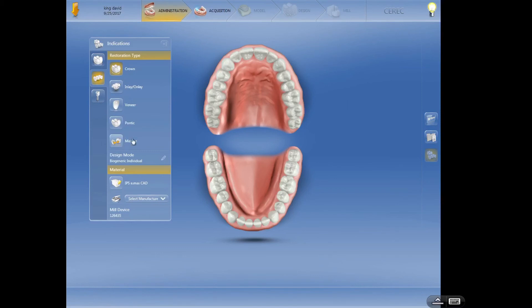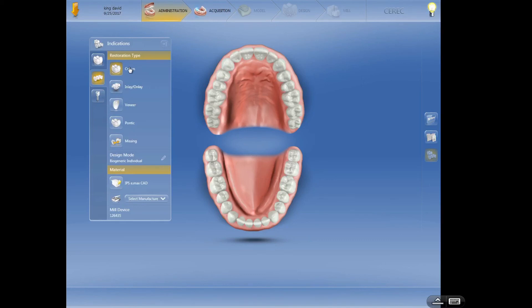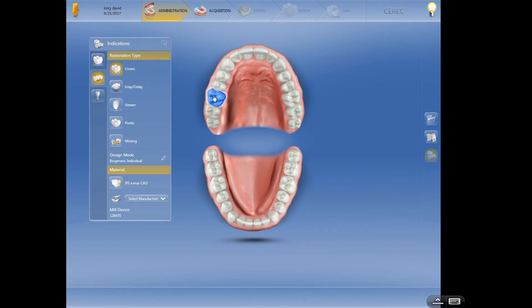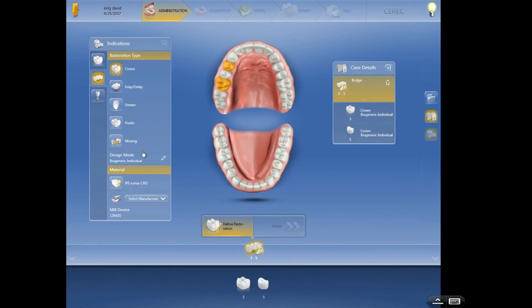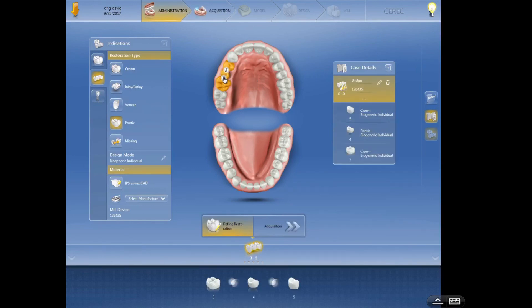So let's talk about the bridge. We're going to select the crowns. Now these are the abutments or the retainers for the bridge. So let's just say we have tooth number four that is missing. We're not going to click that, but number four is missing in the patient's mouth. We want abutments on three and five, so I'm going to select tooth number three, select tooth number five, and then the pontic, the suspended tooth, is number four.